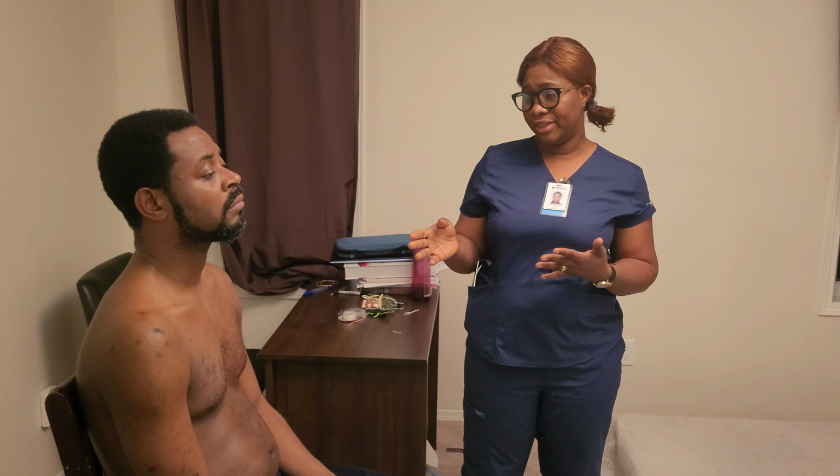I'm supposed to hear vesicular sounds over the lung field area. So from there, I'll move down to the sixth rib. I'll listen to one full respiration in each location. I would also evaluate for normal sounds, which is supposed to be vesicular, and I will note any abnormal breath sounds and any adventitious sounds as well.